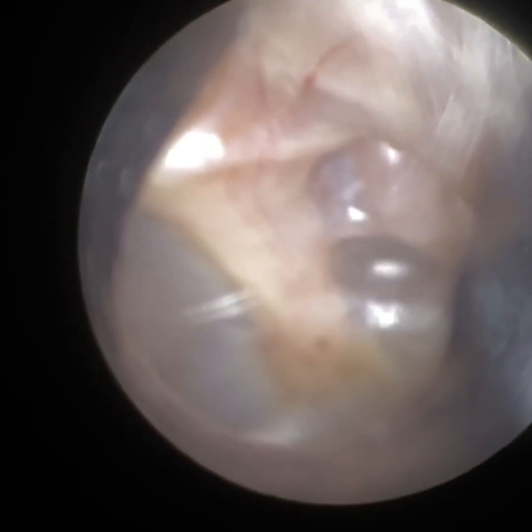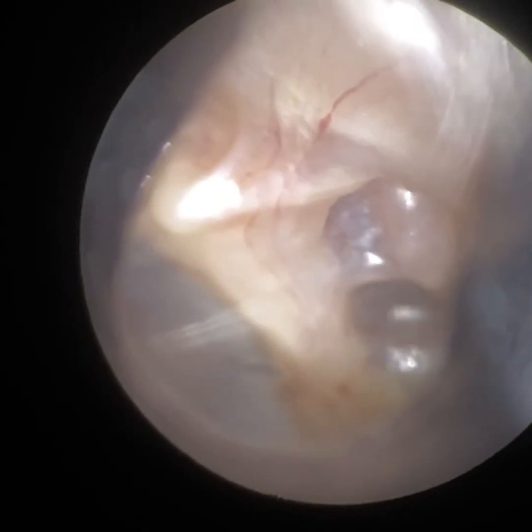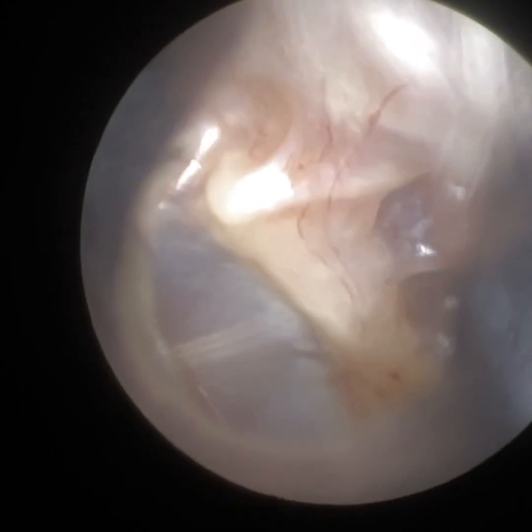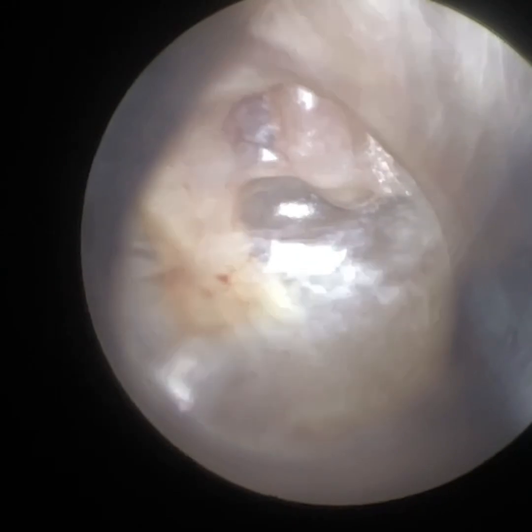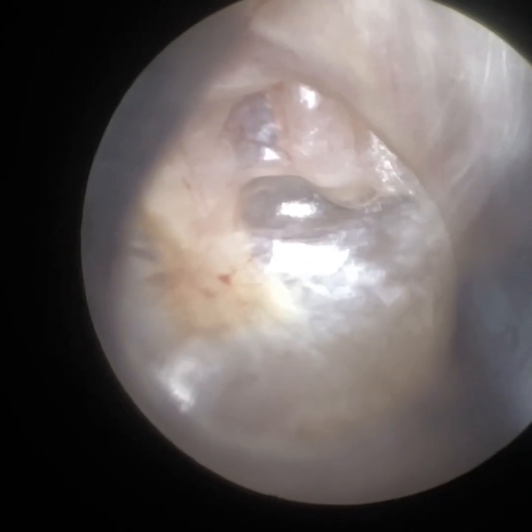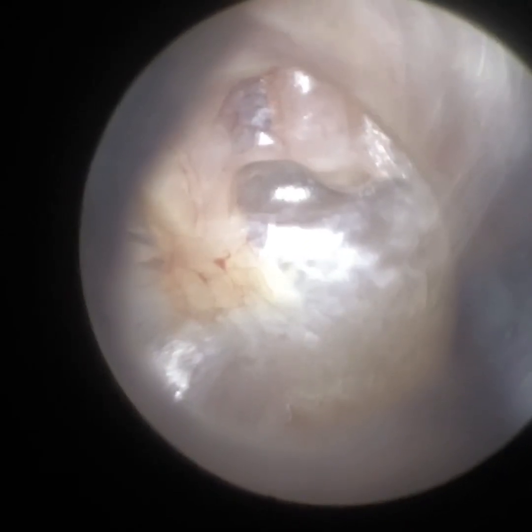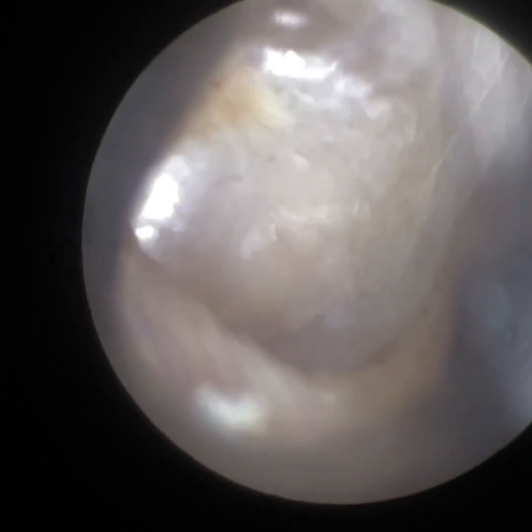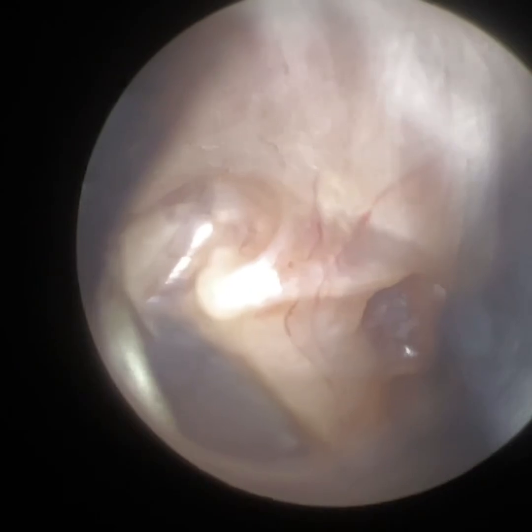So what I'm doing now, I'm just getting the view of the eardrum — you can see how I'm just in focus. You've got the malleus there, you've got the attic retraction, you can see the capillaries and blood vessels, and there you can see — I'm going to go in and out a couple of times — but you can see the long process of the incus. So it's a severe tympanic retraction posteriorly and also in the attic region.